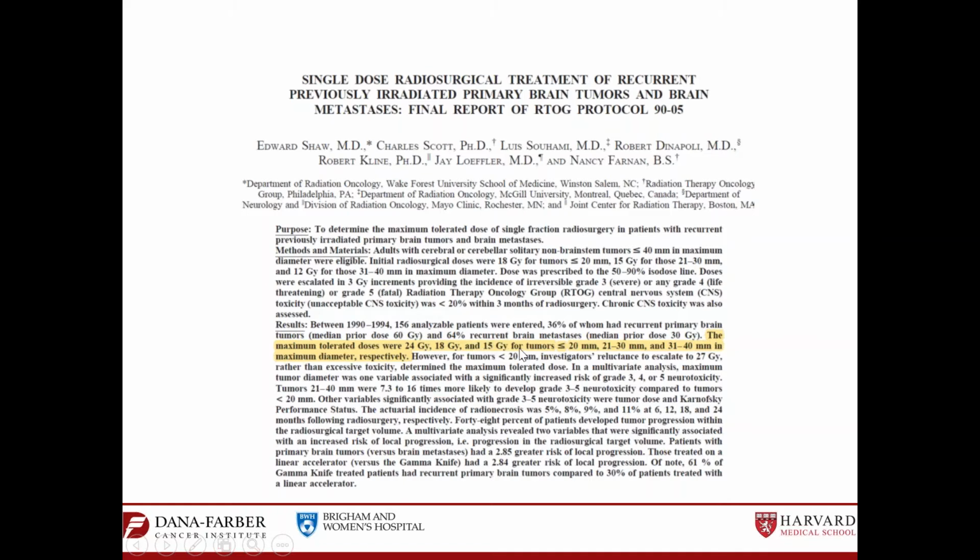And I would say any lesion beyond 3 is considered a little bit large. So if you can, fractionate, like doing stereotactic radiotherapy, SRT, that's better than prescribing 15 gray in 1, because the local control is really better when you fractionate for big lesions.